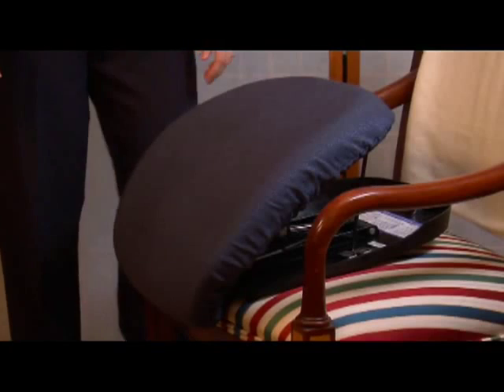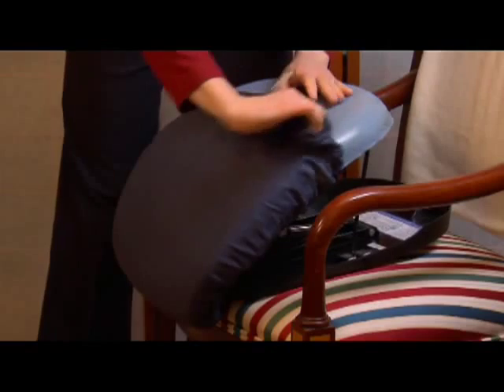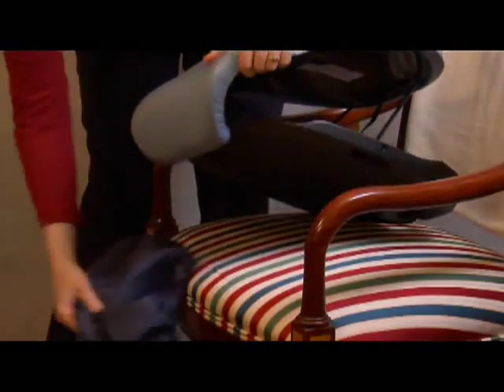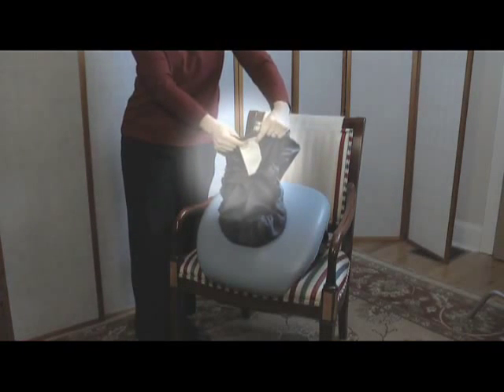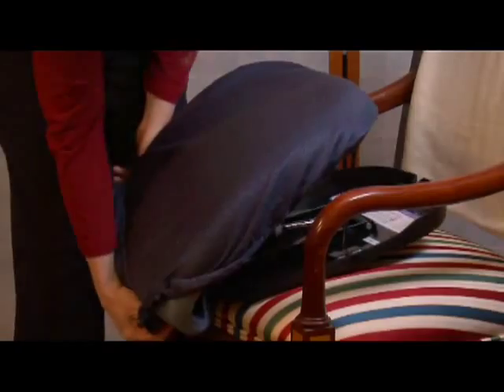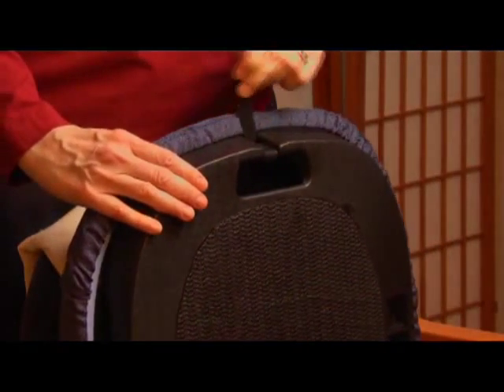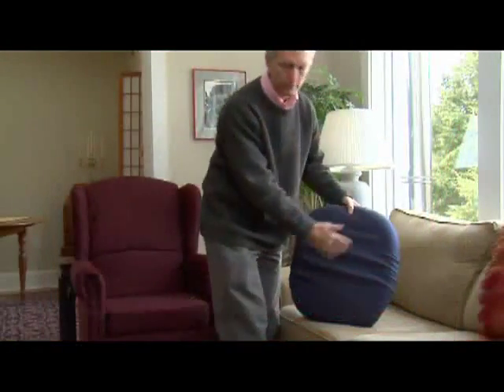For optimal use, the Seat Assist is recommended for people weighing 340 pounds or less. When you want to remove the cover and clean your Seat Assist, simply grasp the end of the cover with the white tag sewn in, lift, and it slips off the cushion. Wipe the cushion with a damp cloth, then machine wash the cover in cold water and let it air dry. To put the cover back on, place the end with the white tag at the top of the cushion opposite the carry handle, and work the cover evenly down over the cushion.